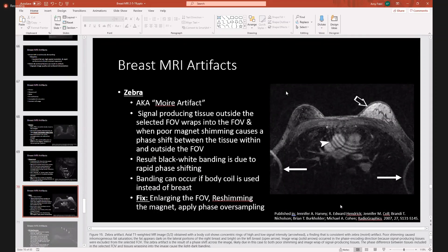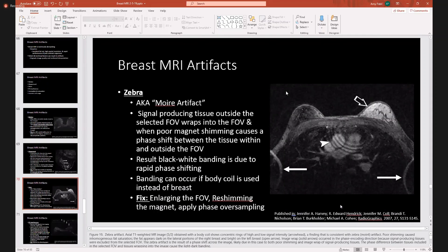Zebra, also known as moiré artifact. Basically, you have signal-producing tissue outside your selected field of view, and it wraps into your field of view. It can also happen when poor magnet shimming causes a phase shift between tissue within and outside the field of view, and you get this black and white banding. To fix it, you can enlarge the field of view, reshim the magnet, and apply phase oversampling.